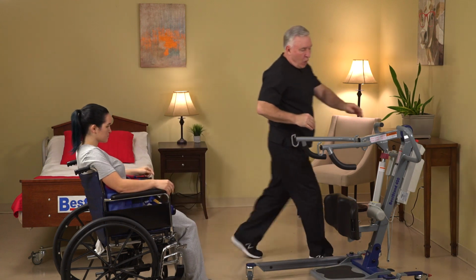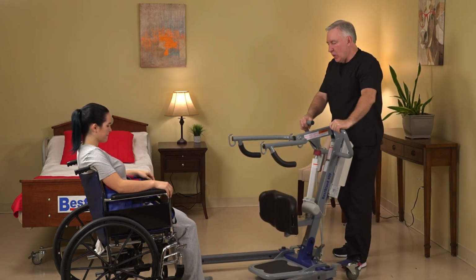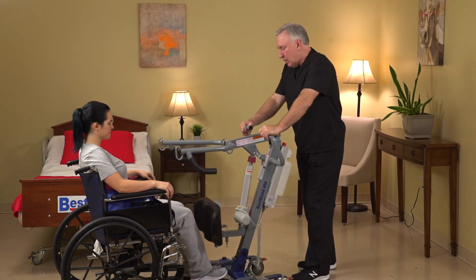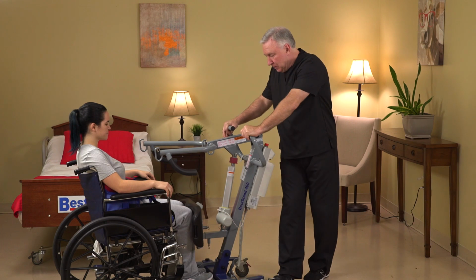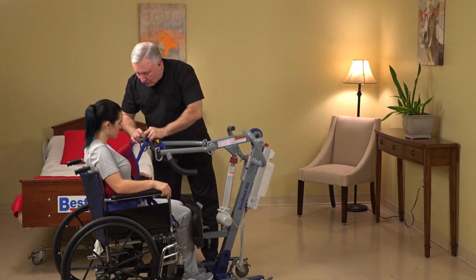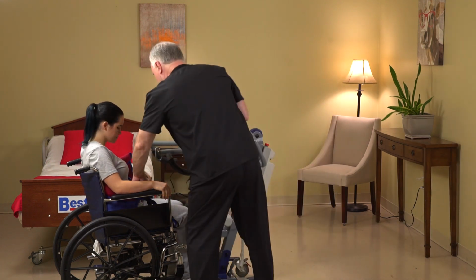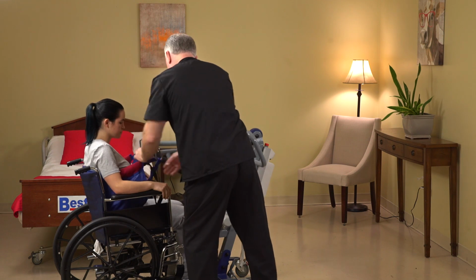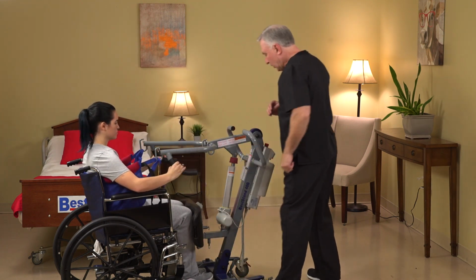Now, we're going to open up the base on the BestStand so we can get around the wheelchair wheels. Approach the patient so the knee brace is up against the knees. Lock the wheels. Take the loops on the sling and connect them to the hooks. Patient's arms are always on the outside of the sling. Hold on to the handles.